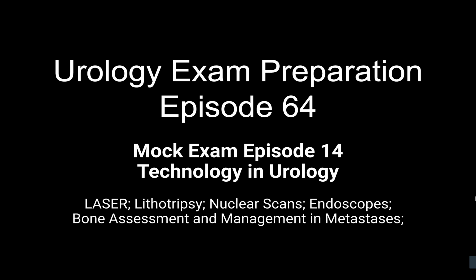Okay, so what is the main advantage of this from the cost point of view? Is it advantageous and why were they introduced? The advantage is that overall it is cost effective, because the cost of sterilization, payment for staff, sterilizing equipment and all that are put into consideration. The disposable scopes are eventually proved to be cost effective.